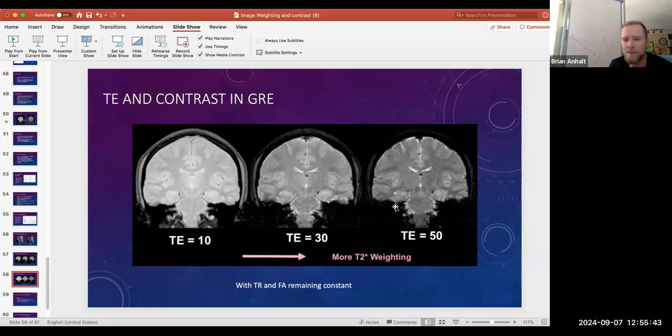So you're going to have to go over this several times until it sinks in. I'm sure this class is too long. Half of you stopped paying attention 2 hours ago. You have to go over this over and over again and replay it in your brain to figure out how it happens. Once you see what's happening, once you can see that what we're trying to do for T1 weighting is to saturate tissues with a long T1 time, then you can see how it works for gradient echo and spin echo. It should be pretty obvious once you grasp the concept of what we're trying to do.